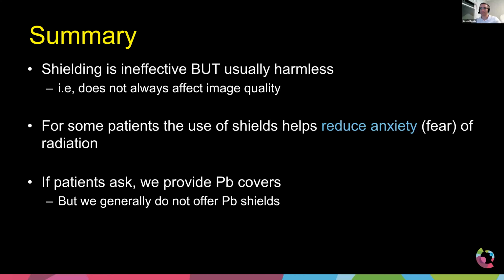Yeah. So lucky us, in Thailand, we don't have a Dr. Oz show who can tell about that. Right? About like the thyroid shield for the mammogram. But come back to the questions here. So how do you educate the patients or the population to know that the gonadal shield is no longer needed?